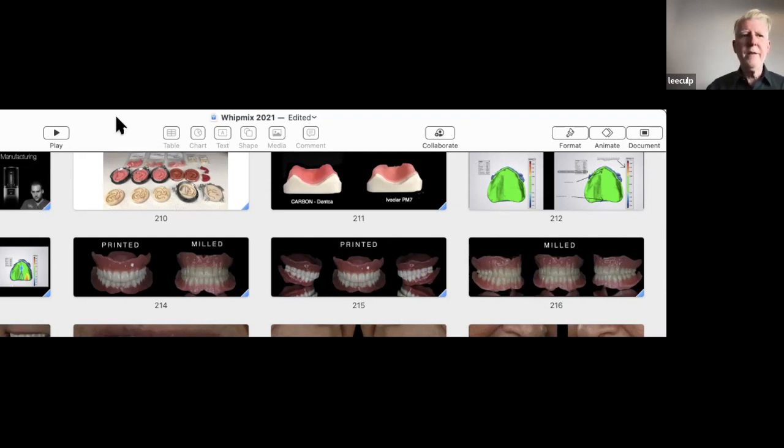If we don't have the tooth and there's a wedding this weekend, we don't have time to redo anything, then you can just build it up with composite. It depends on how big the break is, but you could just build it up with composite. You can also take a denture tooth like you would conventionally do, grind the old denture tooth out, stick the new denture tooth in, and try to get it in there as best you could. Also, if you've got a little time, then you just call your lab up and say, hey, mill me another denture.